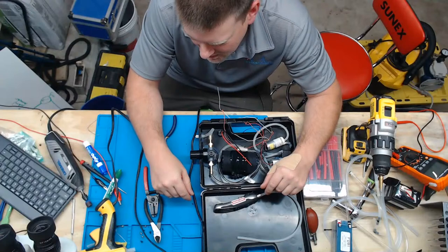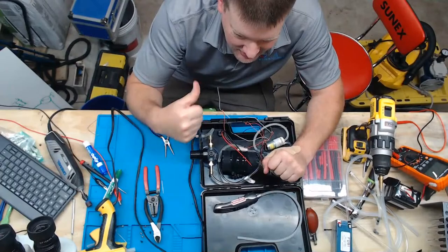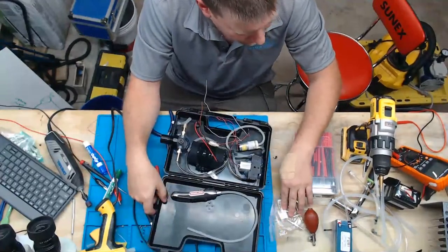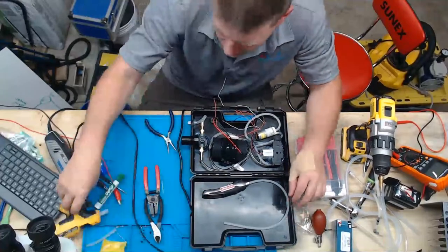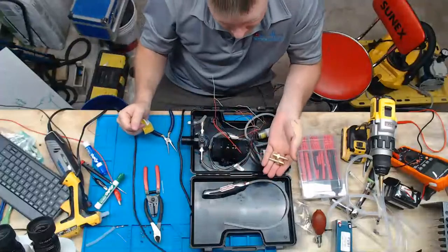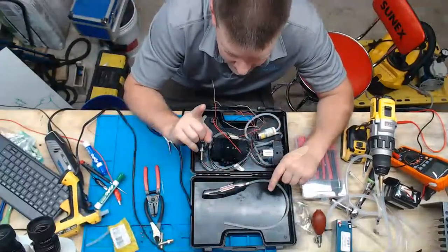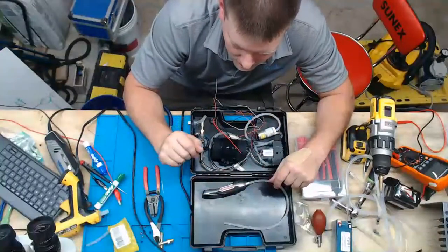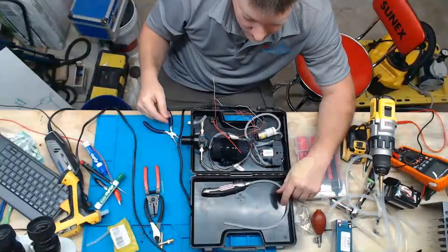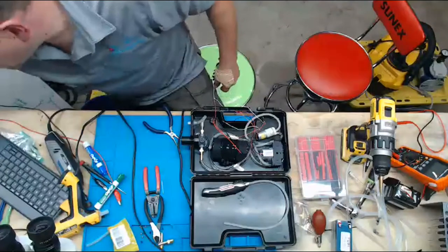So here I am. Bjorn, you are absolutely right. I do have some PVC with some end caps, and I do have plenty of fittings. I've got these style fittings, the screw down fittings, the hose barbs. So I could do something very cool with a small piece of PVC and it would be more efficient. But at this moment, I'm just going to do with what I got until I can prove the concept, and then press on from there.